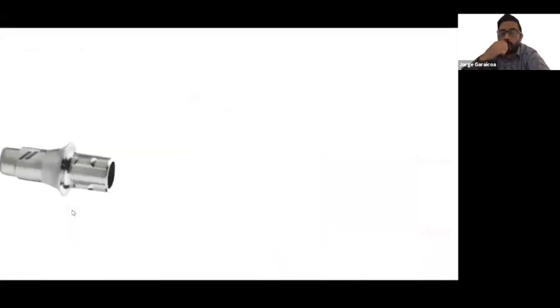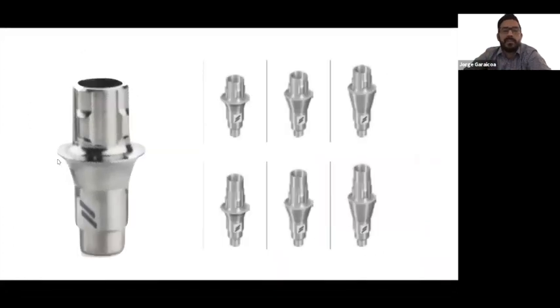Okay, and what you were saying, Mario, I think it's important that we actually choose a company that has some options in terms of the height of those devices. Not just to mention a particular company, because the company you see right here, they don't pay me to do this, but I think it's an important decision as a dentist that you choose a system that gives you some options in terms of the height of those variable bases. Okay, this particular company has 3.5 and 5.5 of this part.